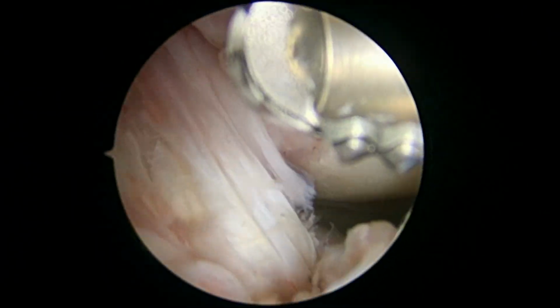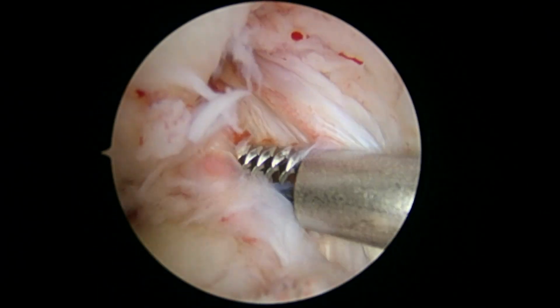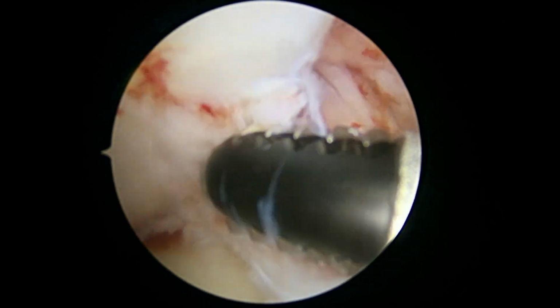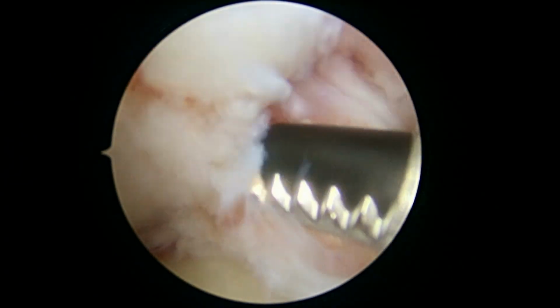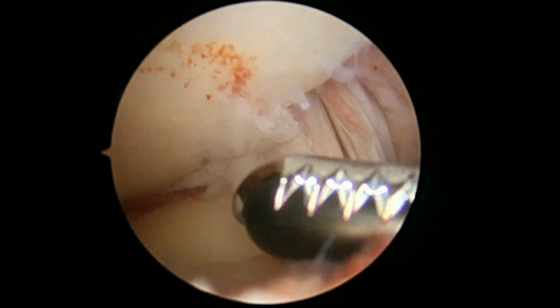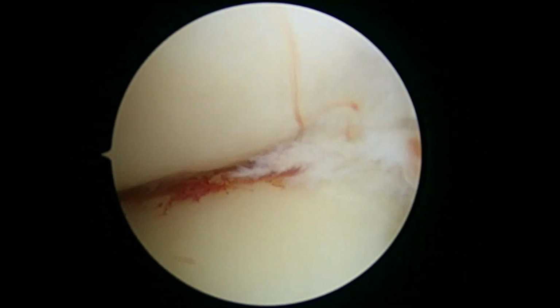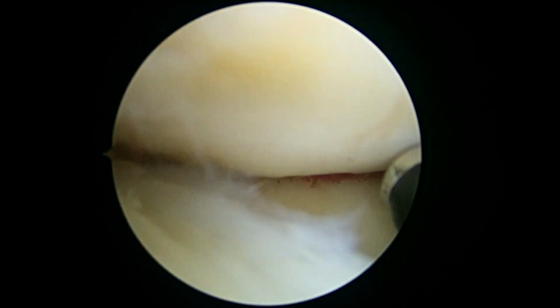You can see the tunnel in the tibia there, and it's got reasonable tension on it. Again, you're not having any instability, so no reason to do anything to that. We're here more because of the loose body. So next we'll go off on the video. We'll look in the lateral compartment.